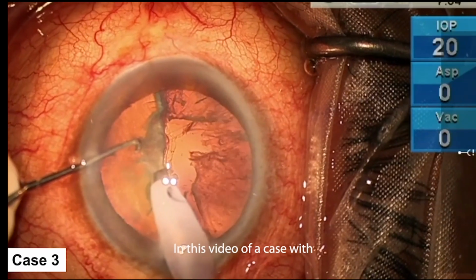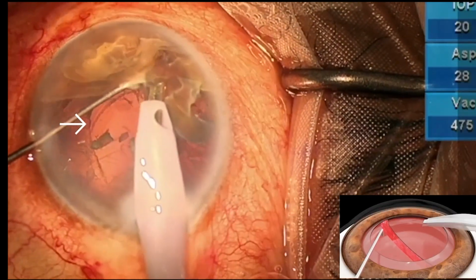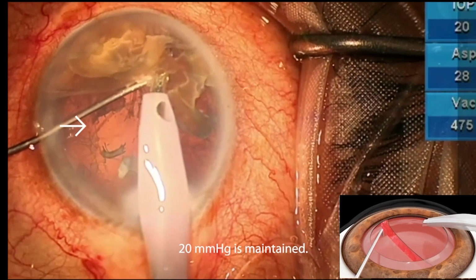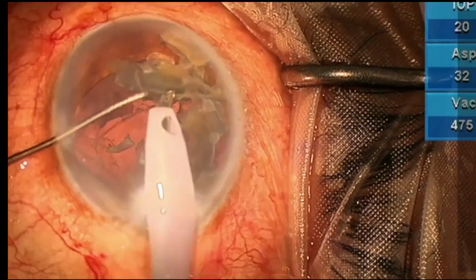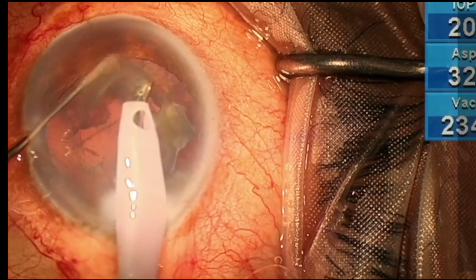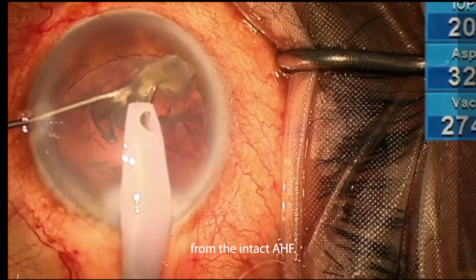In this video of a case with PCR, the PCT edge is clearly fluttering. A physiological IOP of 20 mm of mercury is maintained. Small nuclear fragments are seen floating in this stable environment, while a larger fragment is being emulsified. These smaller fragments continue to rebound from the intact anterior hyaloid face.